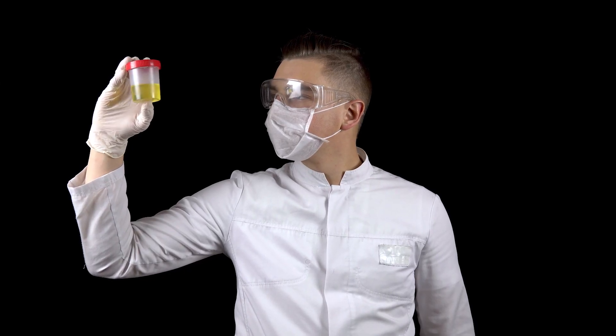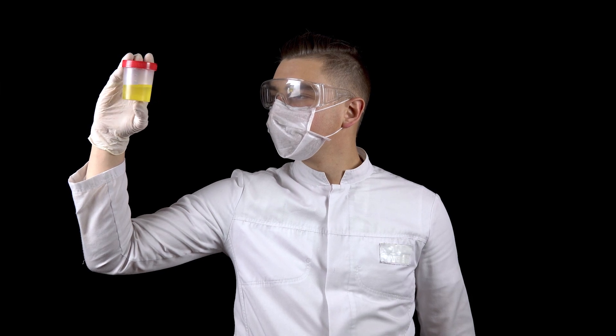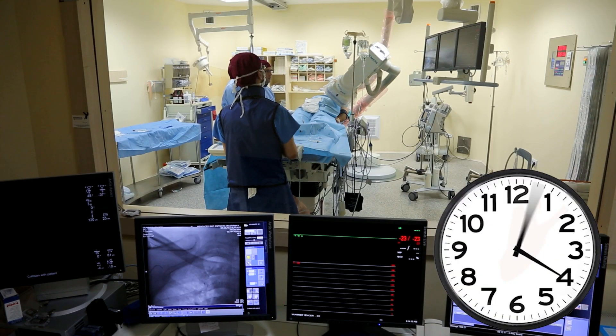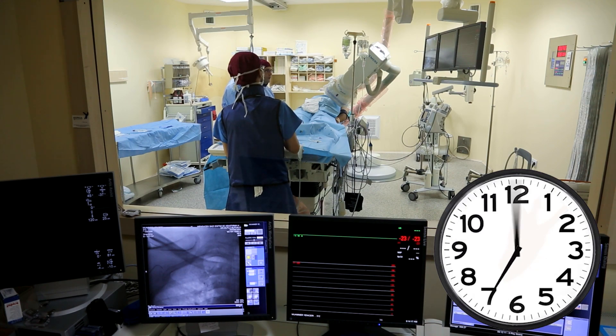The dye is later eliminated from your body through urine. You can expect the test to last half an hour, although it can sometimes take longer.